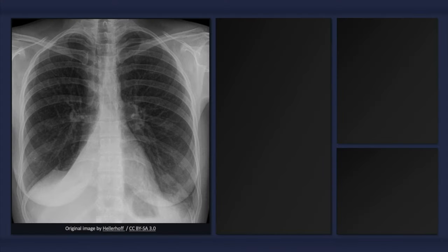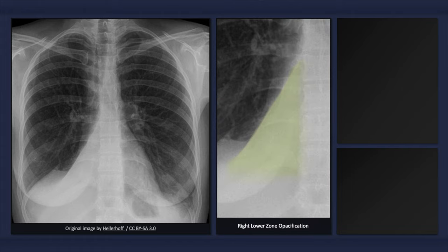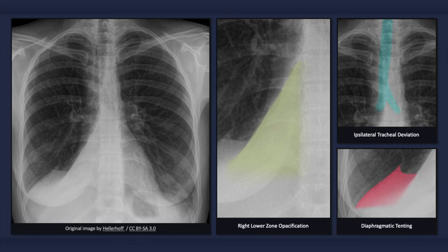On an x-ray depicting right lower lobe atelectasis, we might expect to see right lower zone opacification with effacement of the borders between the lung and both the heart and the medial aspect of the right hemidiaphragm, and signs of decreased lung volume, such as ipsilateral tracheal deviation and diaphragmatic tenting.